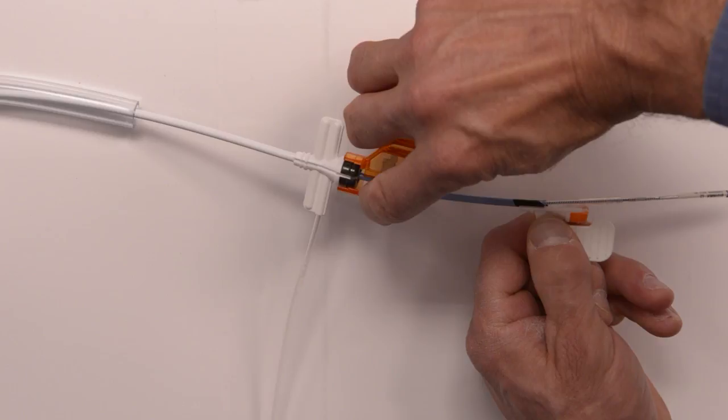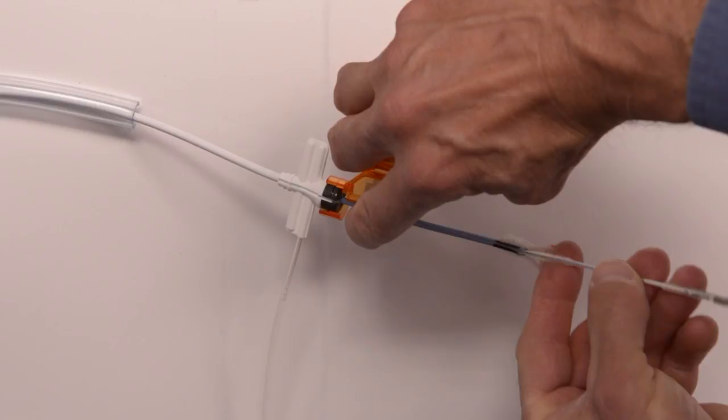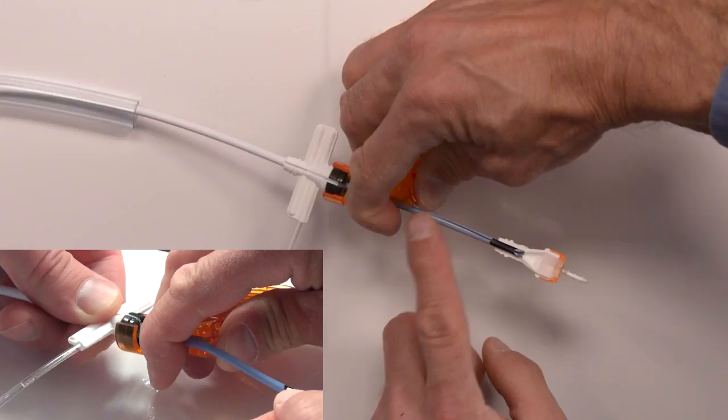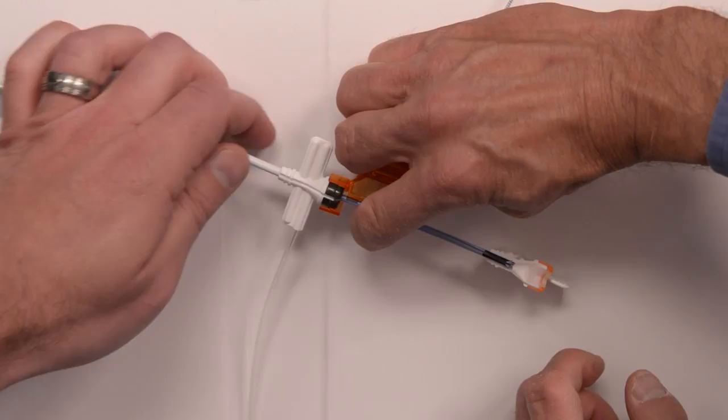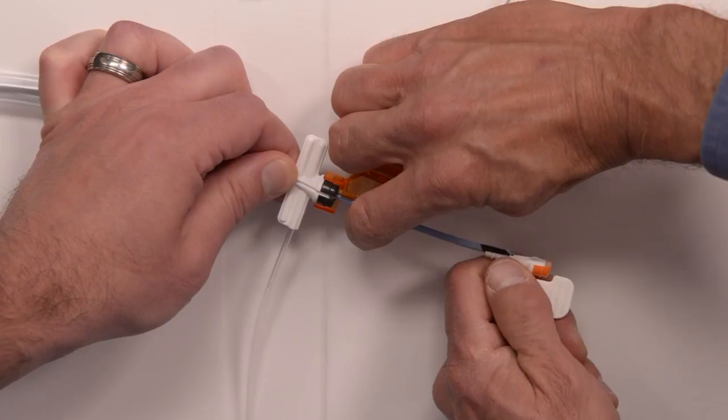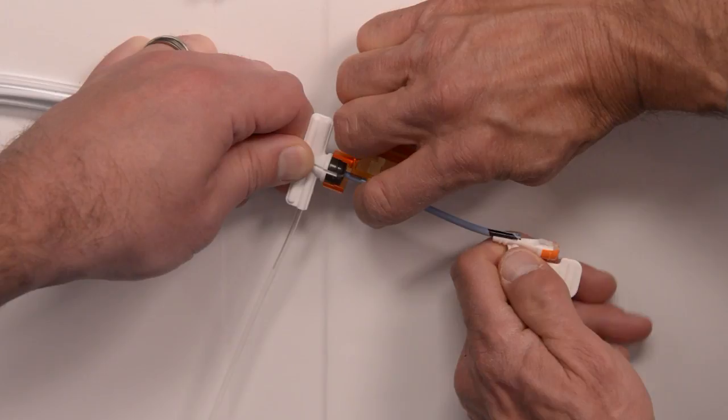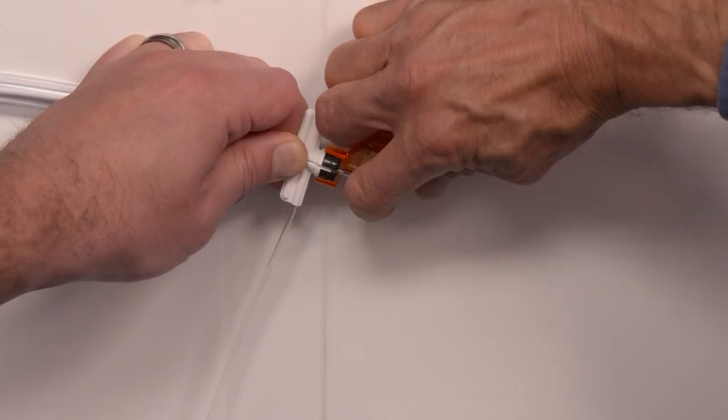Then with my other hand I'm going to remove the lead from the LVI where it's been slit, place it in the slot of the slitter, and hold my thumb right over that very firmly and very close to the LVI. At that point, with my assistant holding the hub of the CSG, I'm going to take the tab of the LVI and pull straight back with one nice long motion—not super fast but also not super slow or intermittent—to maintain the lead right where we put it.